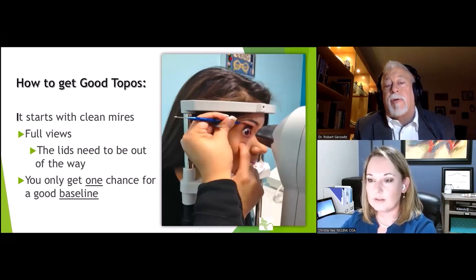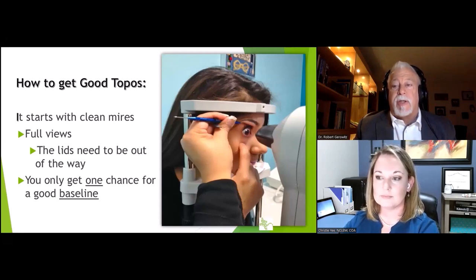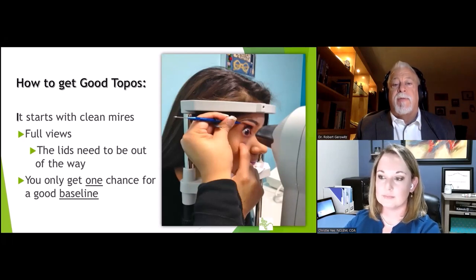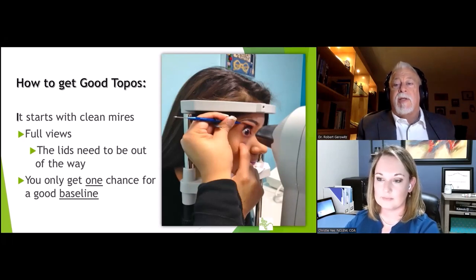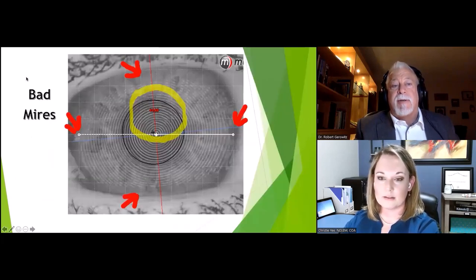Thank you. You know, the other thing is during the consult, I'll look at their topos and I want to figure out what their elevation difference is. And there's a number of different ways to do this, but it's important to know right at the start, am I going to need a toric alignment curve to keep everything centered? And so this is something that I can explain later after the fact. It's best used with visual aids. So yeah, I will do that after the fact.